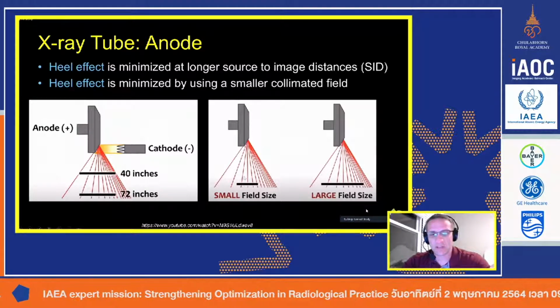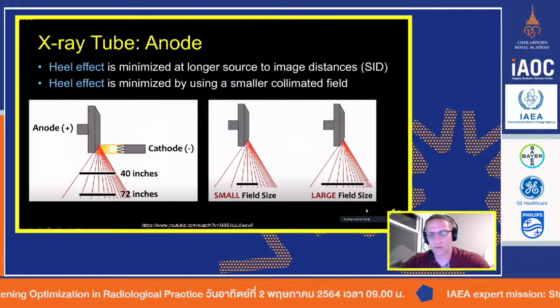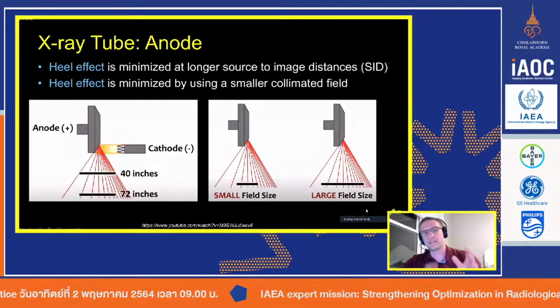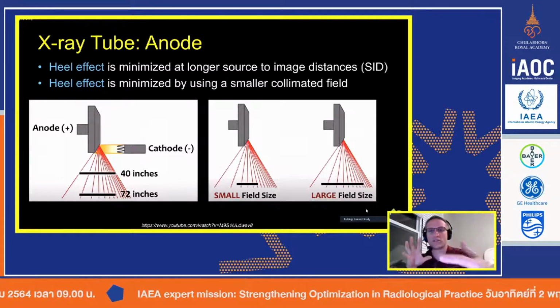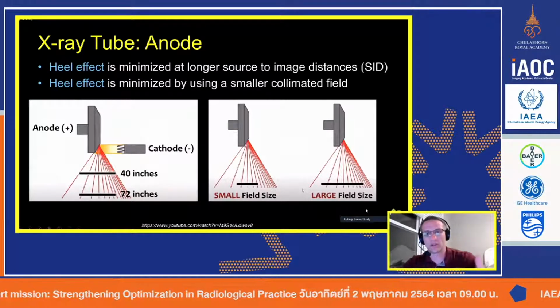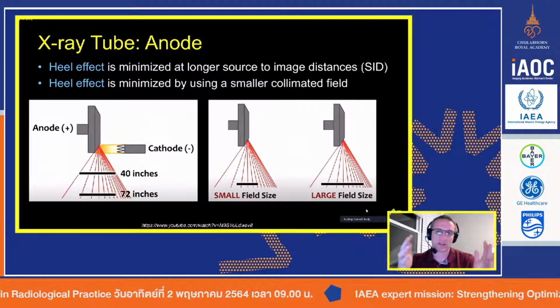You will get more equal uniformity across the field of view versus larger field of views where one side of the field of view will have a stronger intensity. Now, I reckon these are principles that you need to understand when you're setting up and aligning and setting the distances for the patients. But in almost every case, we're limited to what we can do. If you're going to image a big body, a big abdomen, you're always going to use a large field of view. That's just what it is.